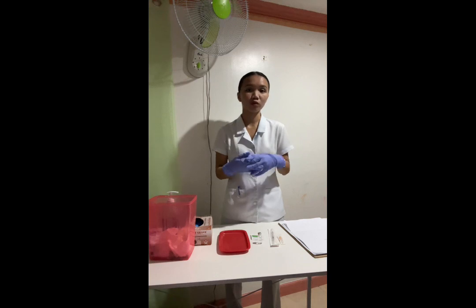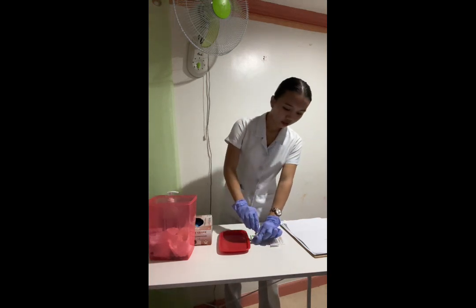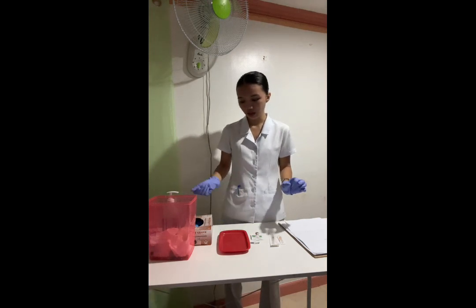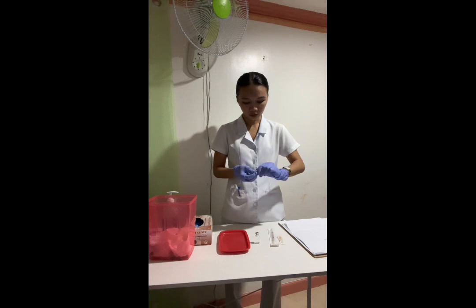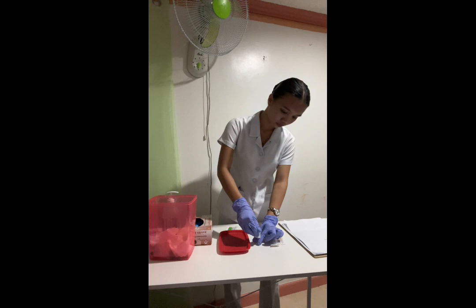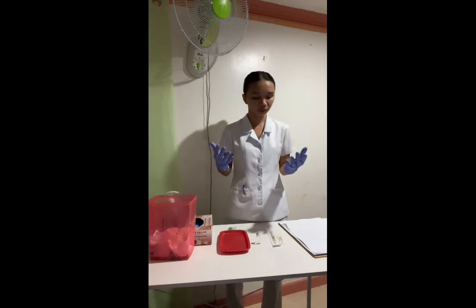Rotating the vial, we have to remove the protective cap and clean the rubber cap of a previously opened vial with an antiseptic wipe by rubbing in a circular motion, because the antiseptic will clean the cap and reduces the number of microorganisms. So as if that I am opening the vial, and then using an antiseptic swab, I'm going to clean it in a circular motion. And then discard.